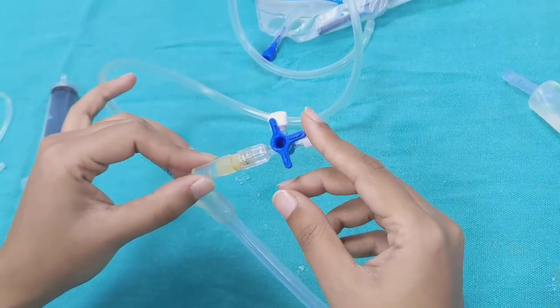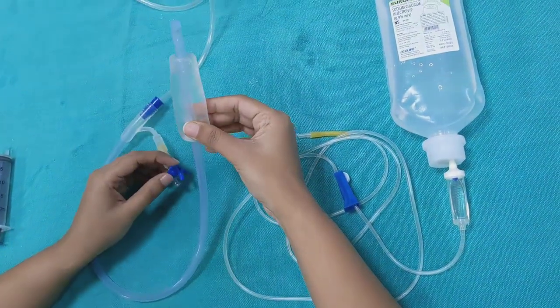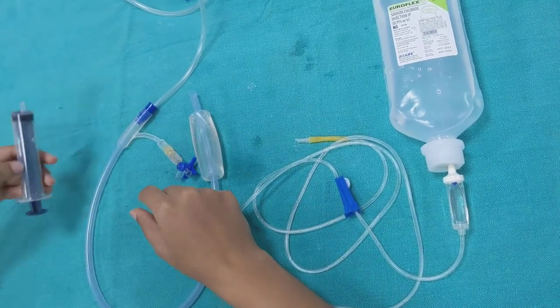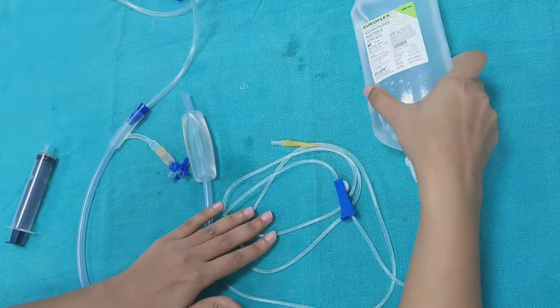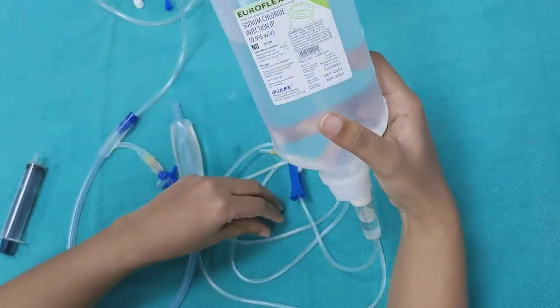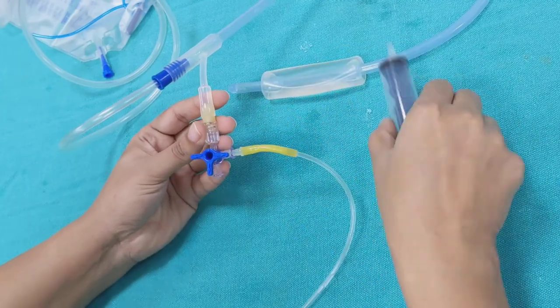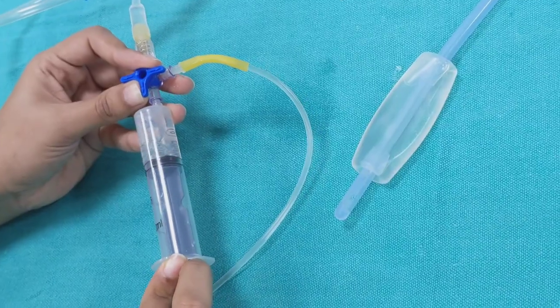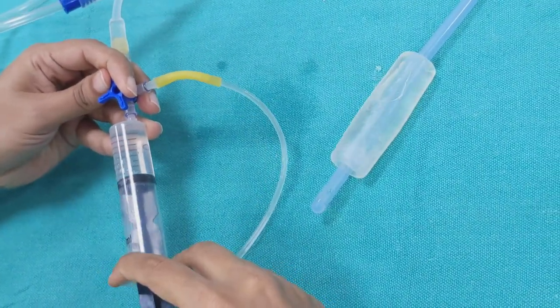Now we are going to demonstrate the installation of this Bakri balloon, for which we are going to need the rapid installation port, a 20 to 60 ml syringe, and the IV tubing that comes along with it. We will connect this IV tubing to a normal saline bag and put it on an IV stand. Then we connect the IV line to one port and the syringe to the other port, and fill the syringe to install it in the balloon.